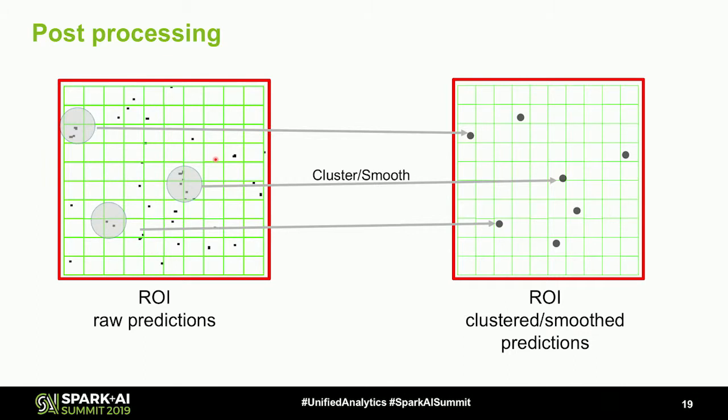After we get the prediction result, some mitoses are very close to each other. The competition organizer rule requires that if the distance between two true positive predictions is smaller than 30 pixels, then they will treat them as the same prediction. But if these two predictions are wrong, then they will treat them as two wrong cases. So we want to cluster the prediction results to increase the F1 score. Here we use DBSCAN to cluster the predictions.